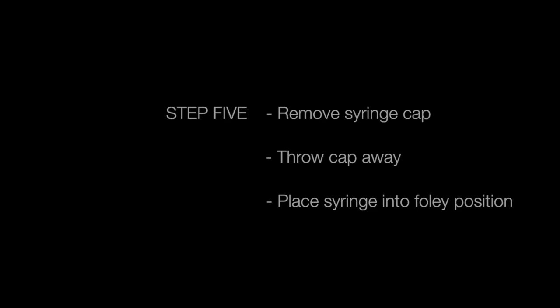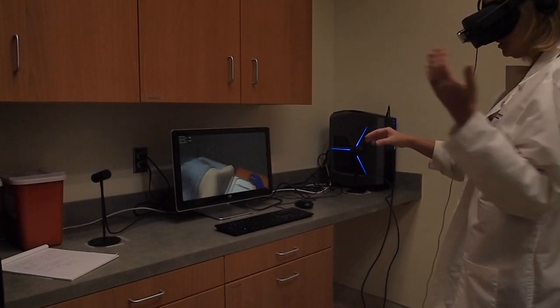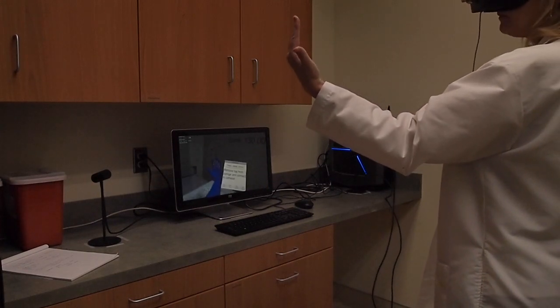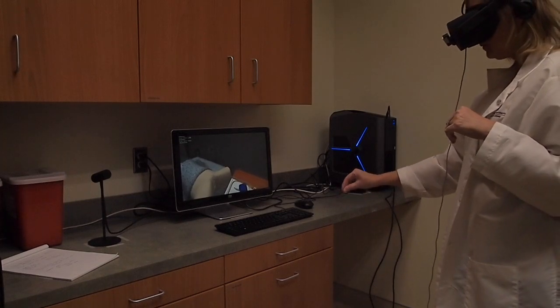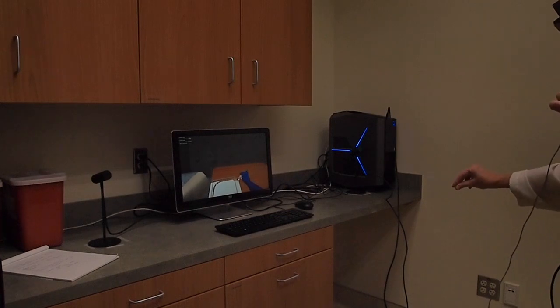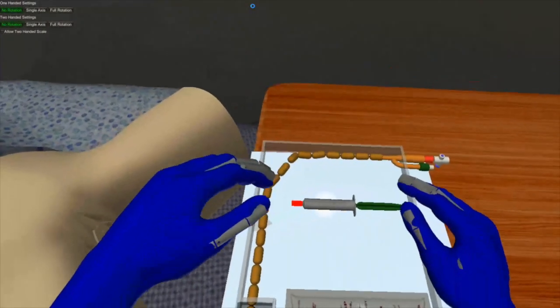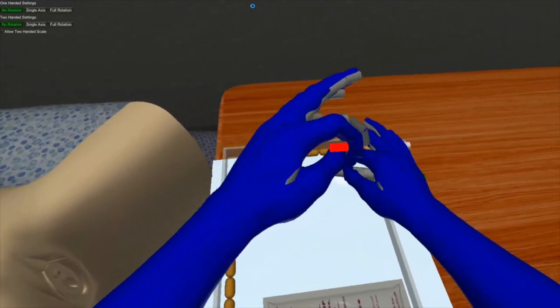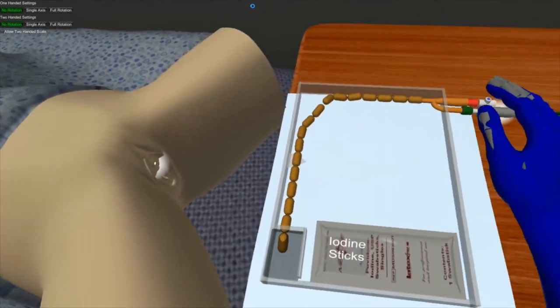Next, we will prepare and place the syringe. Looking towards the package, the next step is to remove the cap from the syringe and connect it to the catheter. Pick up the syringe with your right hand, take off the syringe cap, throw it away while maintaining sterile field, then place the syringe in the syringe input tube.